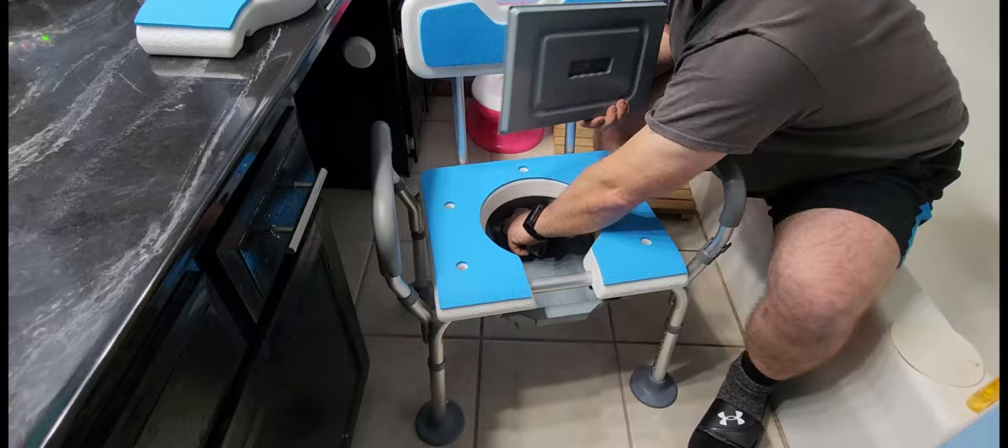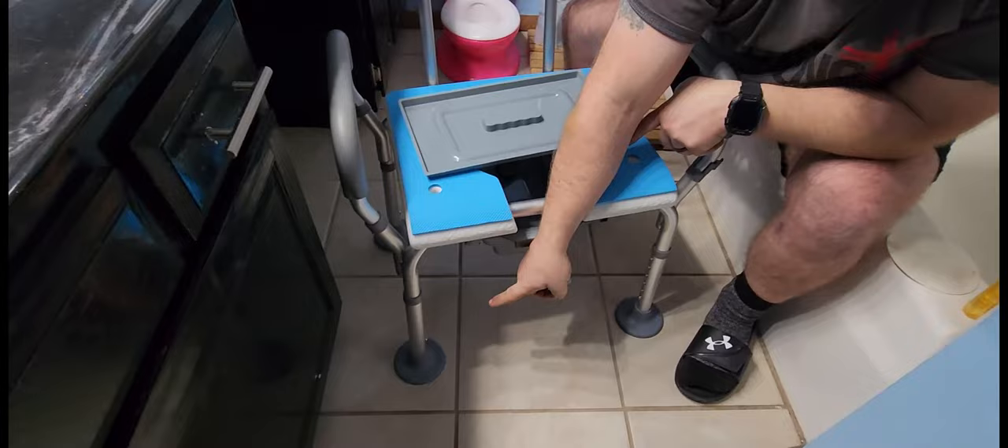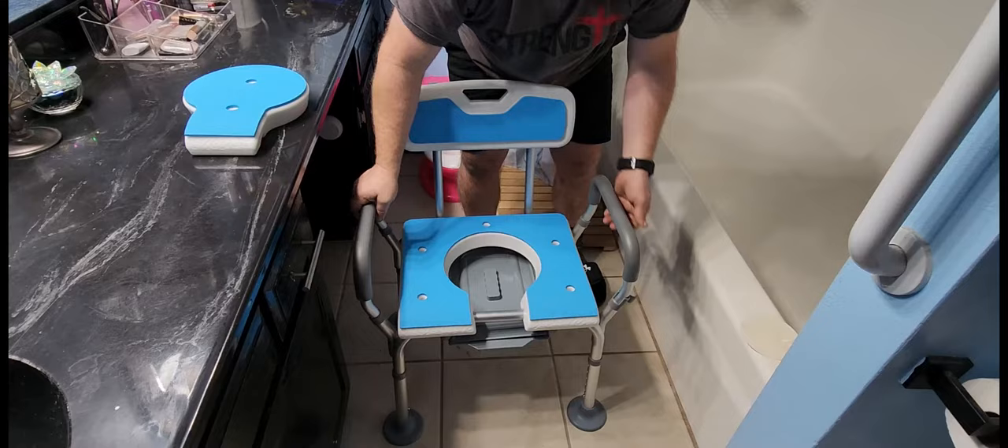They give you two different sets of feet. These smaller feet are beveled a little bit, so they might work better in your shower or tub. We went ahead with the larger feet for greater stability.